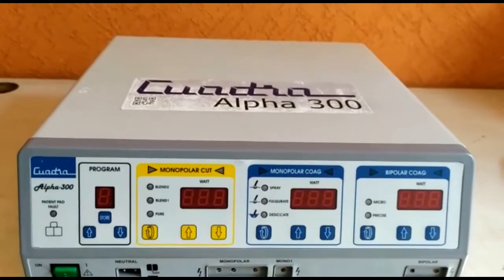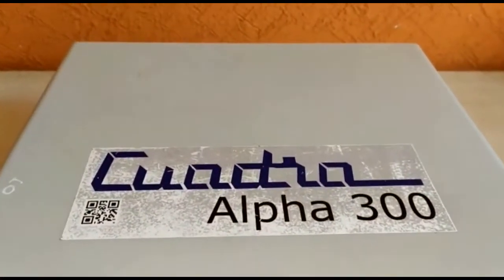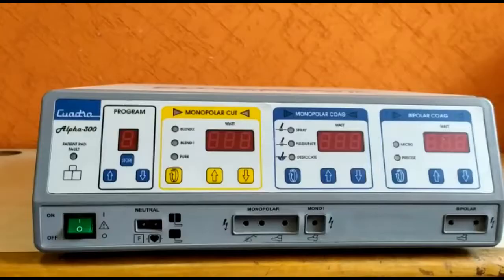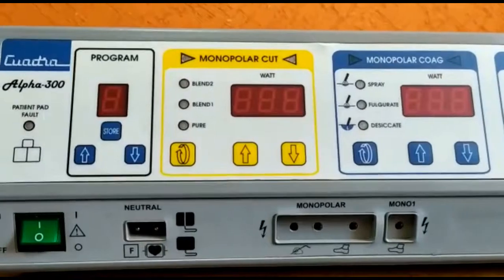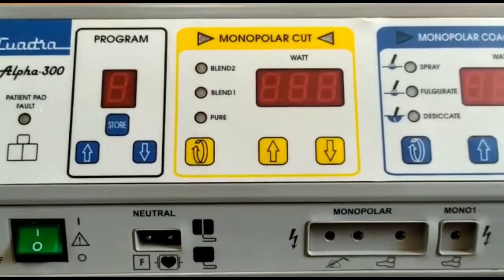This is the Cuadra Surgical Diathermy Alpha 300. The Alpha Series has 3 models: Alpha 200, Alpha 300, and Alpha 400. The maximum power rating for Alpha 200 is 200 watts, for Alpha 300 it is 300 watts, and for Alpha 400 it is 400 watts.